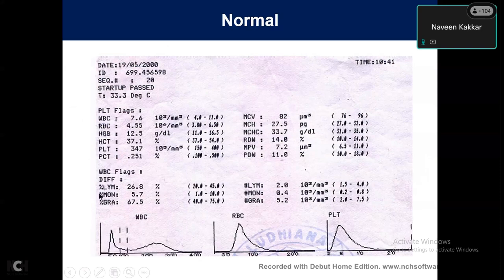And in this one, it calls it monocytes. But usually this is mixed, and it is this zone in the center. So your lymphocytes fall here, your granulocytes are in the higher volume zone, and your monocytes, eosinophils, and the companies do say basophils, tend to fall in this zone. So that's how you interpret a normal histogram. That's WBC. For RBCs, the volumes. And for platelets, again, a cutoff is usually 20, 25, or 30, depending on the instruments.